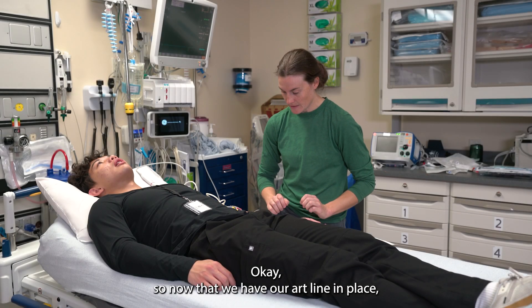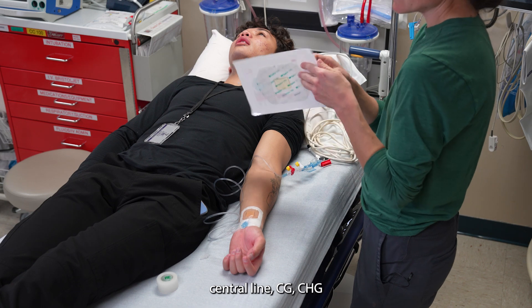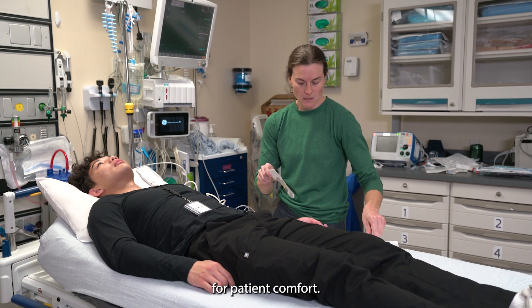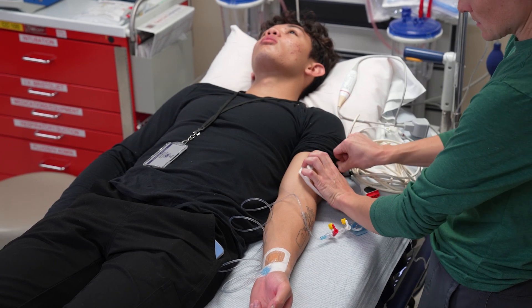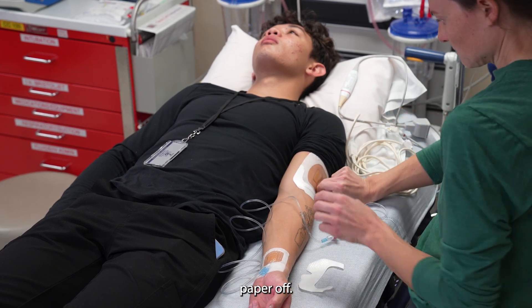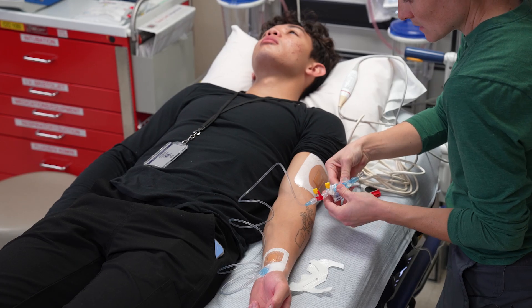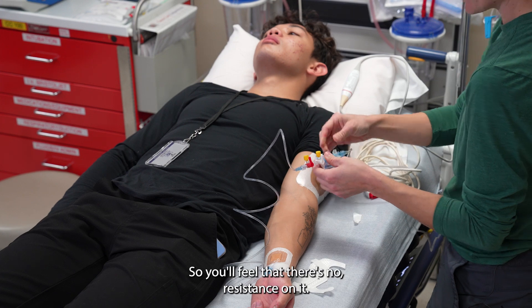Now that we have our art line in place, we're going to go through the steps of securing it. We have a central line CHG dressing that we're going to open, and this just helps to cushion the transducer for patient comfort. I'm going to stick it on my patient here — it doesn't matter up or down. Then I'm going to get all the tape and paper off. I grab my cable and I'm going to twist and lock this cable in like this, so you'll feel that there's no resistance on it.